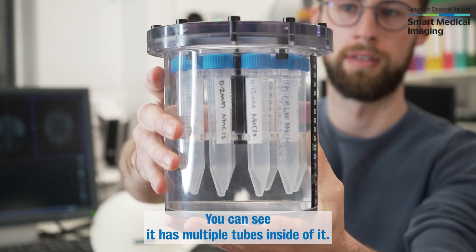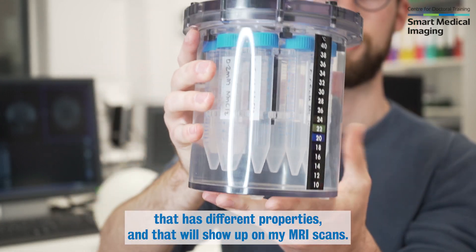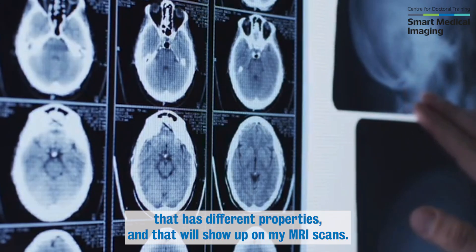So this is the fancy phantom. You can see it has multiple tubes inside of it, and each of these tubes contain a different liquid that has different properties and that will show up on my MRI scans.